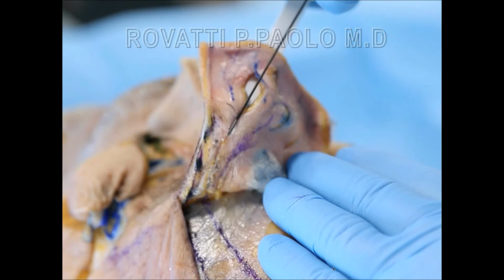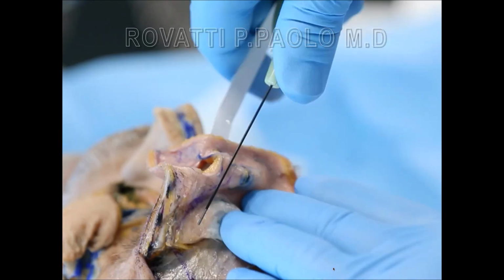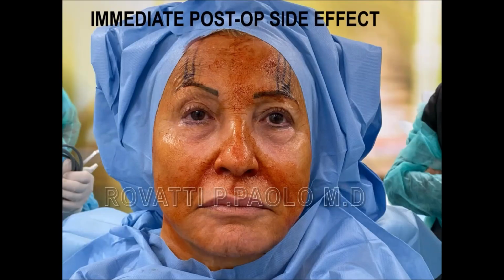But sometimes you can have this effect immediately after the treatment. Don't be afraid, it goes. Okay, this is the infrared camera. You can see that above our eye, you have a line of treatment, of heating, that is white. And this is what happens, some paradoxical effect immediately post-op you can have, but usually it's a contraction of the muscles, but it can stop after, you can look here, but it usually fades away after 24 hours and not more than 2 days.